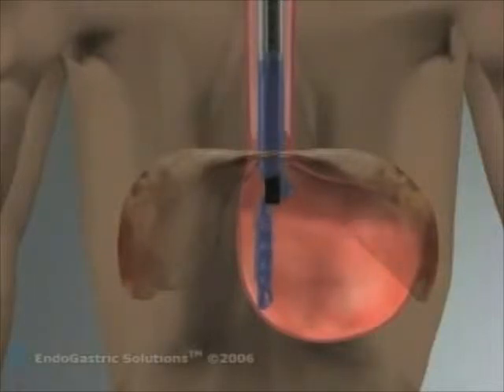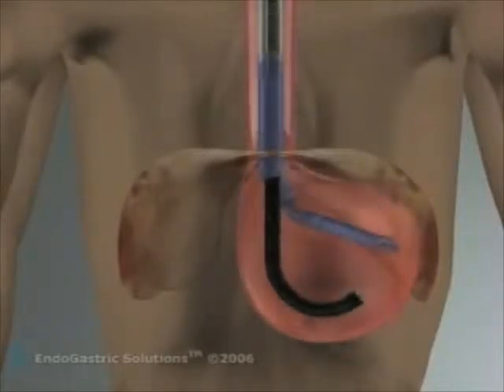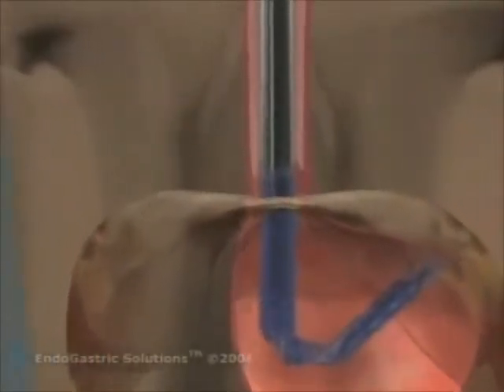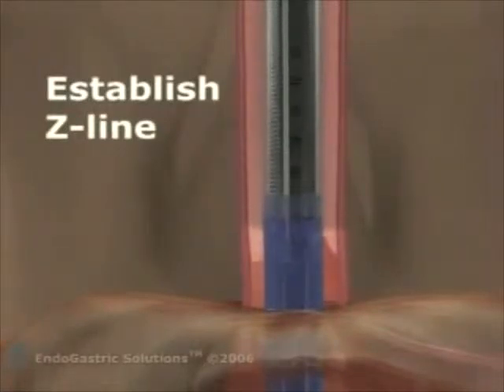The mold of the device enters the stomach first and is positioned for surgery. As you can see, every step of the esophagus procedure is performed under visualization and through a clear window. The operators can precisely line up the device through a series of simple maneuvers to position its marker at the Z-line.